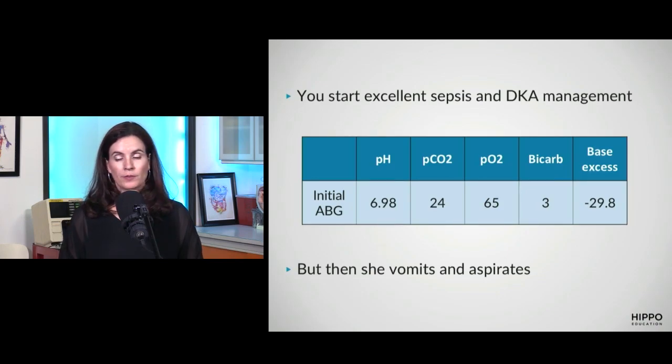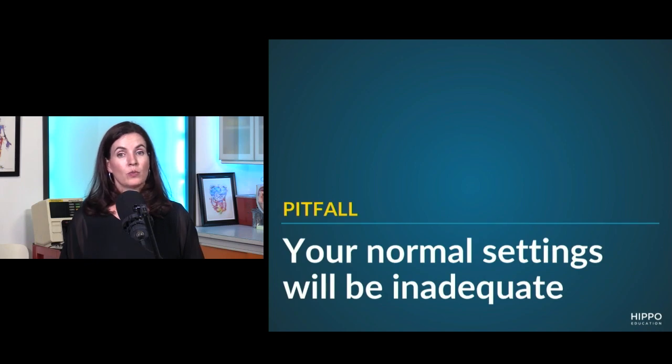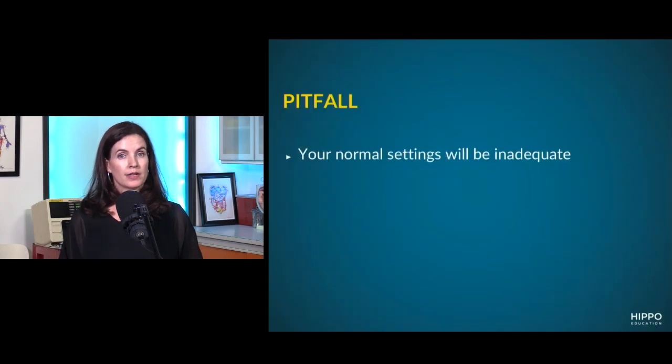So we intubated her, and that part went smoothly. The intubation itself wasn't difficult. The hard part now is setting the ventilator in a way that can manage her acid-base status. And so the key here to remember is that your normal default settings will not be adequate for this lady. If you go with your normal settings, this lady will arrest typically within 60 seconds or so. So we need to make some changes to how we set the ventilator.